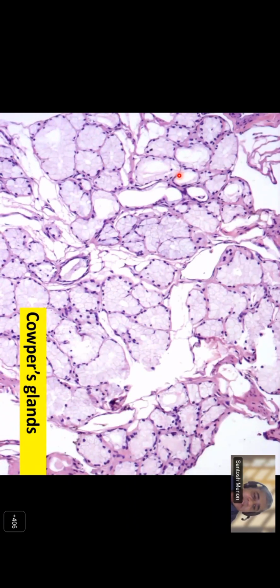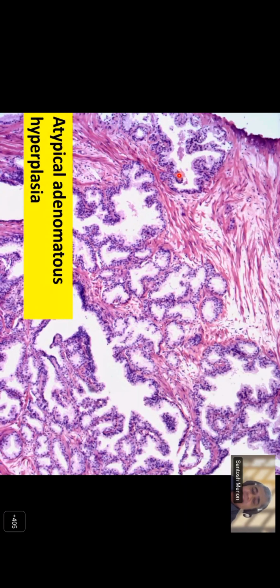These have this wispy kind of appearance, very lobulated appearance, and they are huddled together and look very characteristic. Atypical adenomatous hyperplasia, I don't know whether we use that term, Verma sir. Do you use it in the UK? It is generally recommended not to use this term because there's nothing atypical about it, and atypical might scare people. So we should not use the word; we use adenosis.